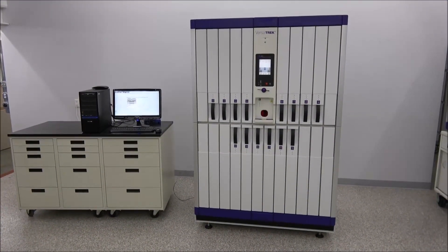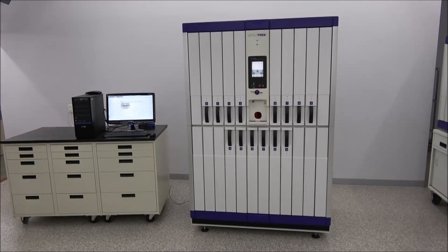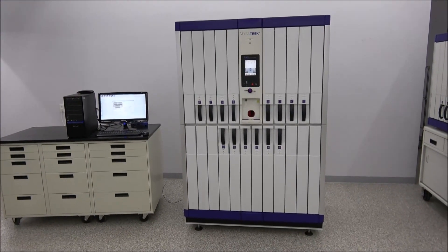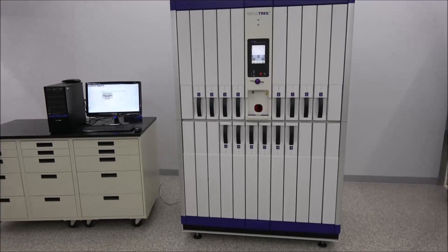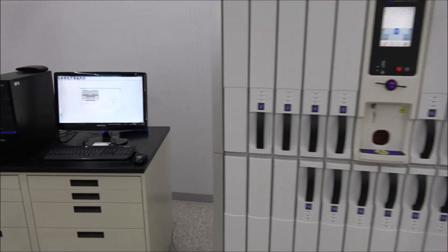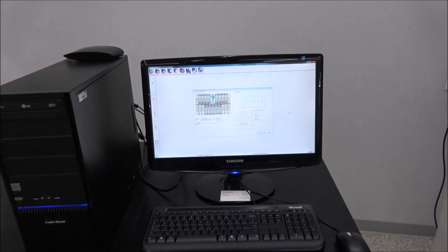Hi, this is Rich with New Life Scientific. Today I've got the Versatrec. It's a microbiome detection system with 14 drawers and 336 bottle slots — a lot of capacity for everything you need. It also includes a computer with software installed.